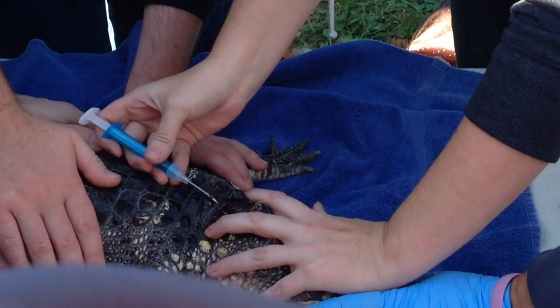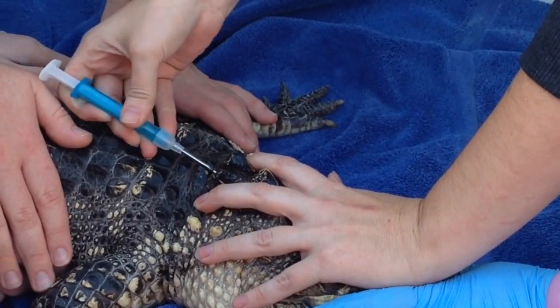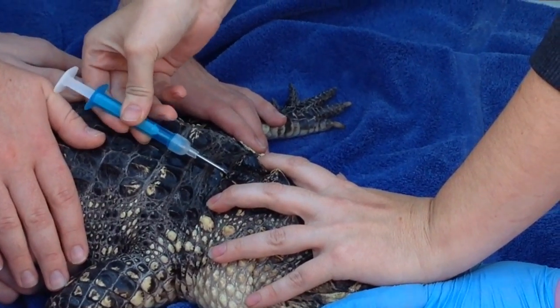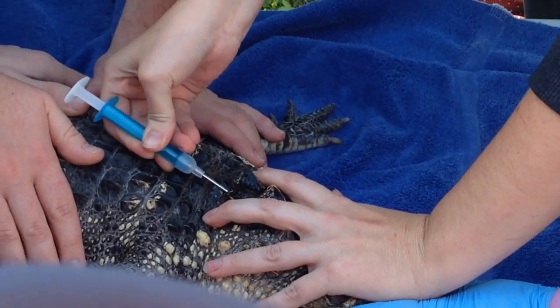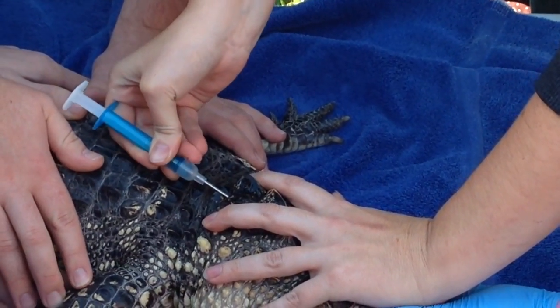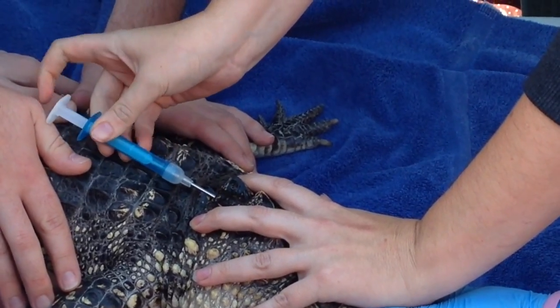Do you have my hand yet? Right here? There you go, perfect — just like this. Keep twisting, but don't push it in yet. Don't push the microchip in. You're doing perfect. Good job. A little bit more. A little more. Don't worry about stabbing. That's good right there, I think that'll work. Hold it level. That's good.